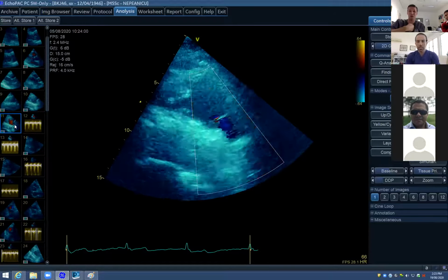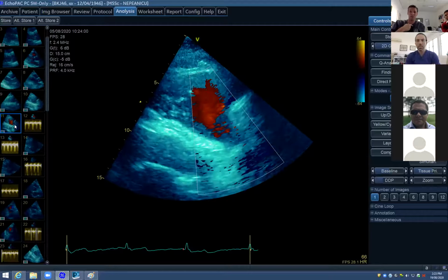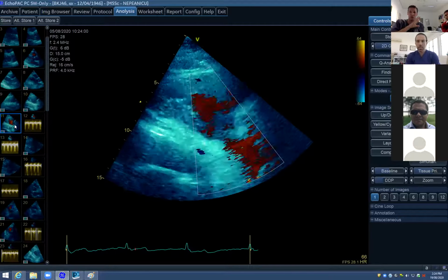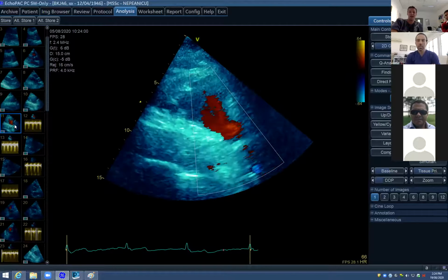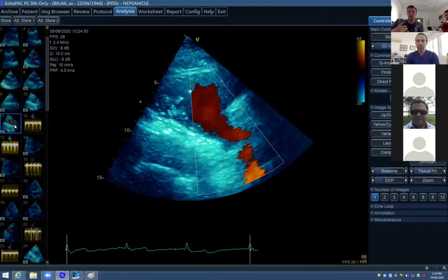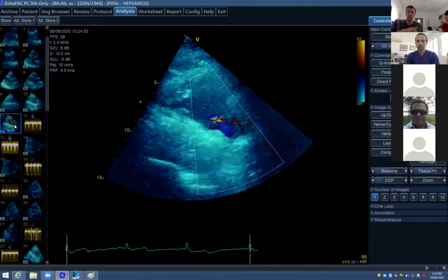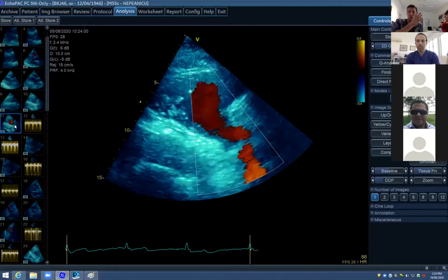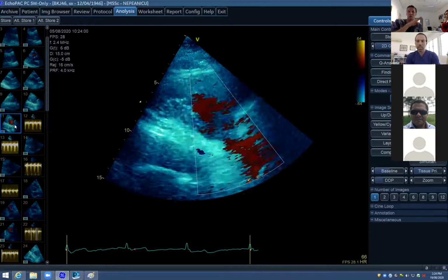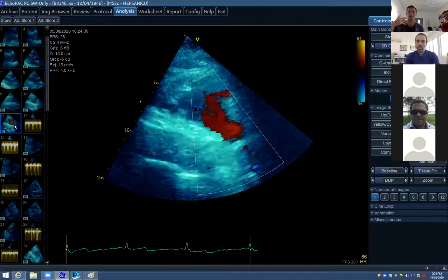The next one is the short axis view at the level of the aortic valve, where we can tilt over and look at the tricuspid valve there. Then we've got our apical 4-chamber view, and even sometimes in the subcostal region, if we've got a slightly eccentric looking TR jet, you can sometimes get the TR jet in that 4-chamber subcostal, or you can go into your short axis in your subcostal view and do that. So you've got 5 different views to try and find the maximum velocity.